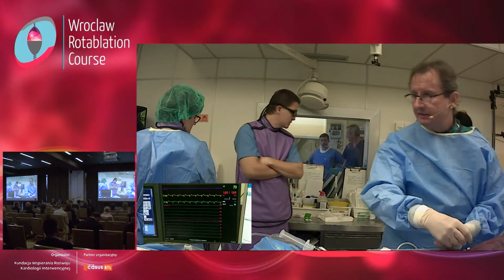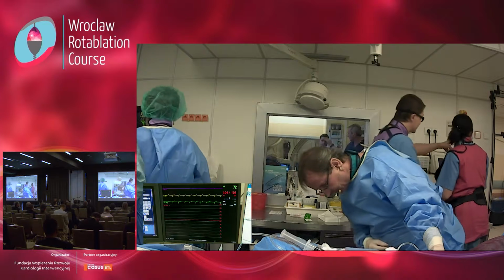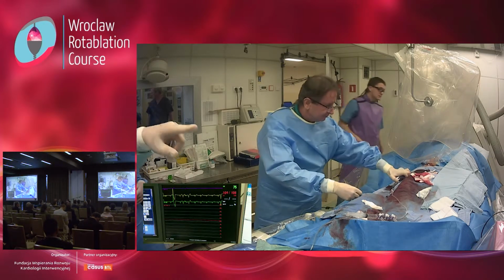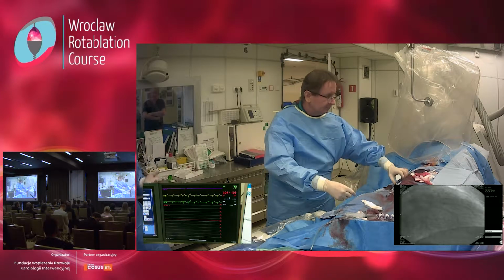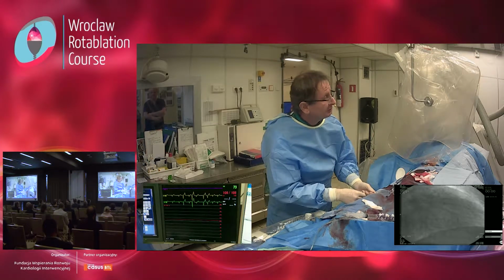Okay, now we test the speed. We have dyna, so now we go to 165.